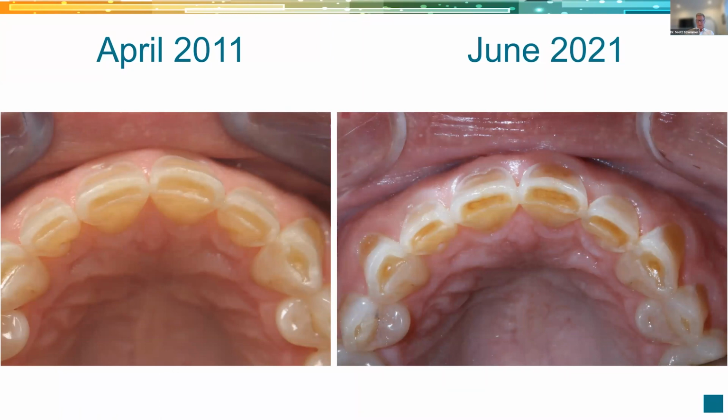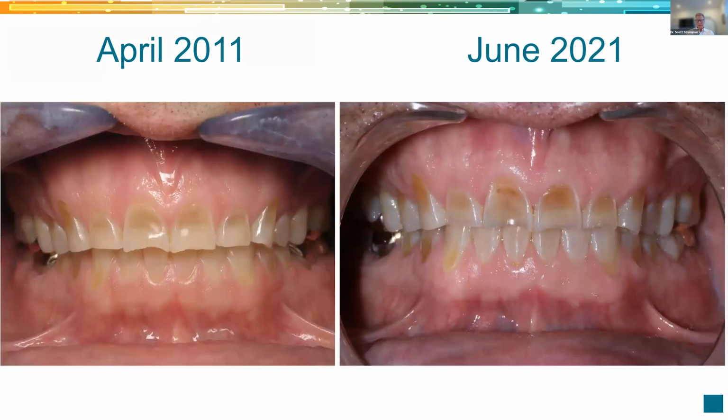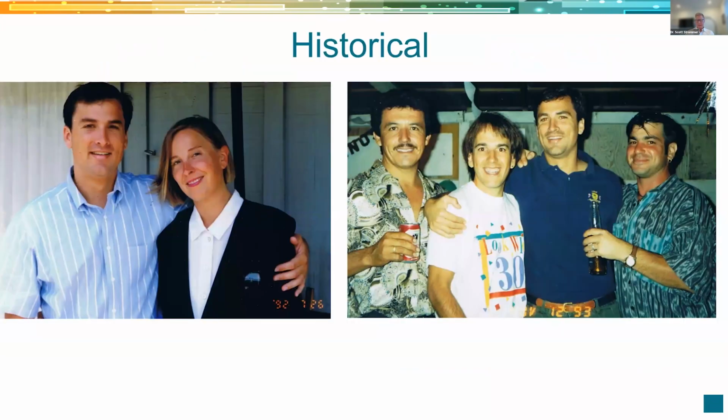Just one final view here. You can appreciate even on these areas in the incisals how much enamel had been breached, and we have the dentin exposure here. And then we come over here, you can already see it's just expanding. Everything's deeper, more pronounced as we're going through. So here's our basic photography. We're going through the case.